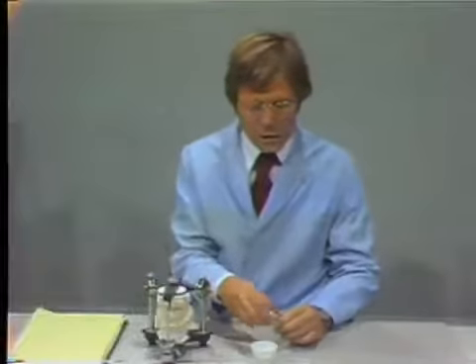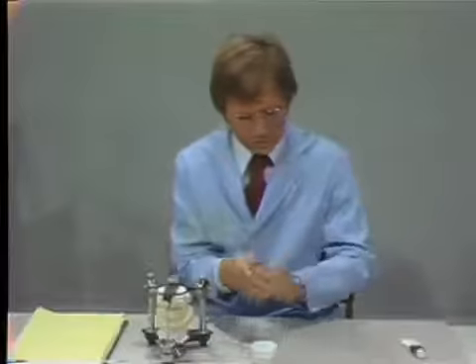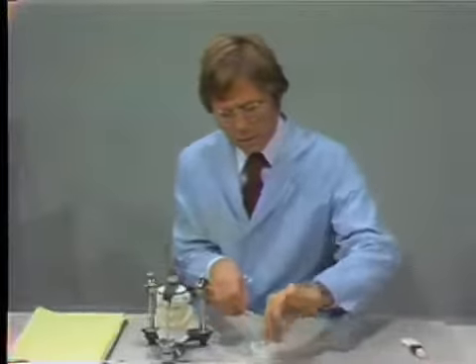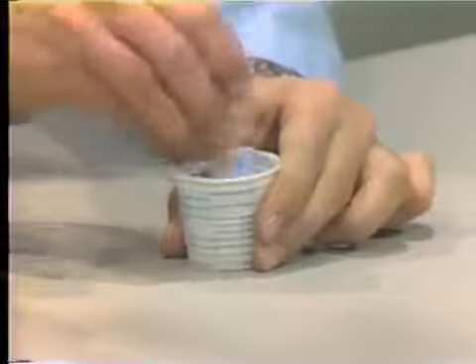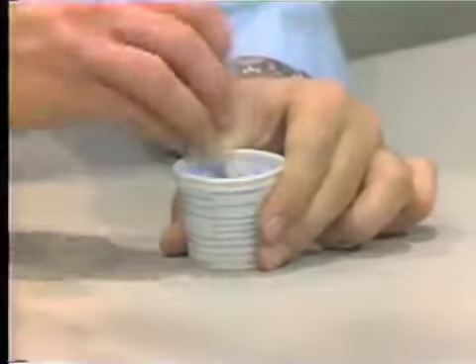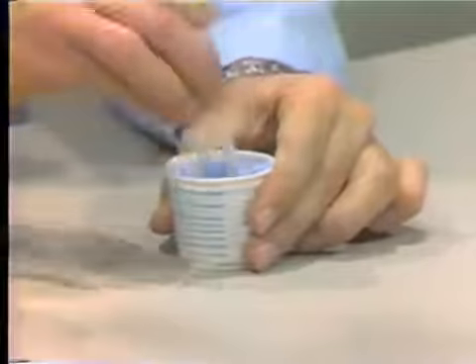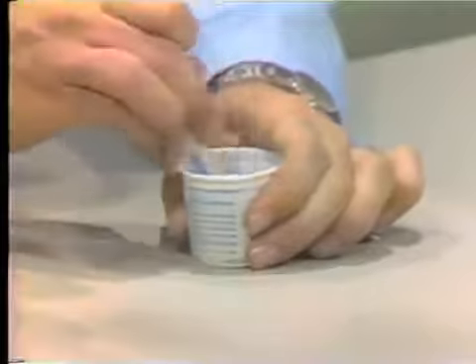Now I'm going to Vaseline my fingertips with just a little bit so that when I'm handling the acrylic in its doughy stage, it's not going to stick to my fingers. I'll then mix the acrylic and wait until it reaches its doughy consistency, or a handling consistency.